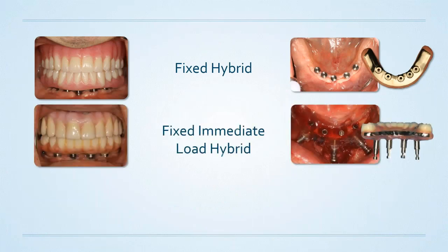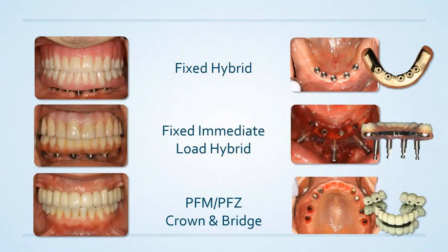Fixed solutions include what you see here on the screen. The traditional fixed hybrid, sometimes known as an all-on-4 or all-on-5 prosthesis. A fixed immediate load prosthesis delivered the same day that the implants are placed. And additionally, the, quote, ultimate prosthesis, which is the PFM or PFZ restoration, which is individual implants where you have very natural transitions between natural pink tissue and porcelain tissues or white tissues.